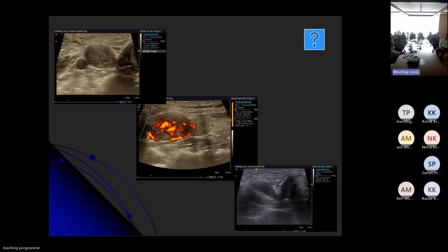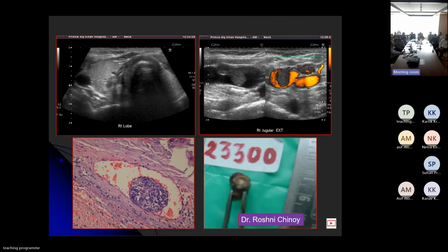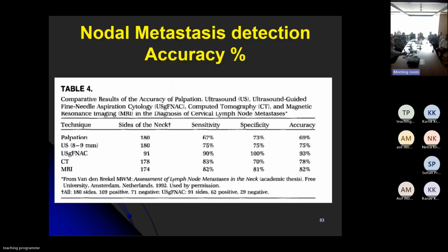I think I'll skip this. The schwannoma can definitely look like a node, but the vascular pattern is very bizarre. And in such a scenario, this is a papillary cancer with large metastatic burden. I think the ultrasound would not be sufficient because the nodes are going to go to various levels, including the mediastinum, and we need cross-sectional imaging. This was one node which was considered a node outside, but when we realized this is a tumor thrombus and not a node, papillary cancer or thyroid follicular cancer can tend to overflow into the jugular vein and cause the abnormality.